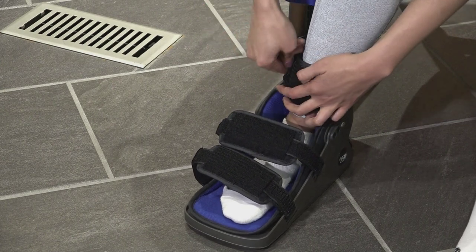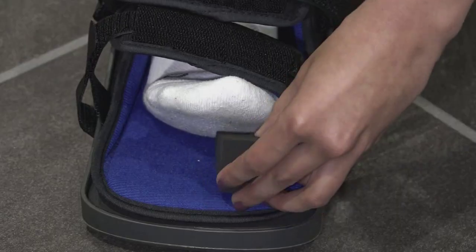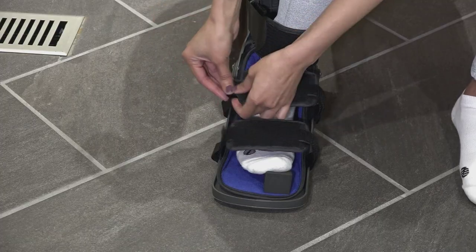Then fasten the ankle strap. You will want this strap to be snug. Next, insert the toe wedge under your big toe, then fasten the foot straps.